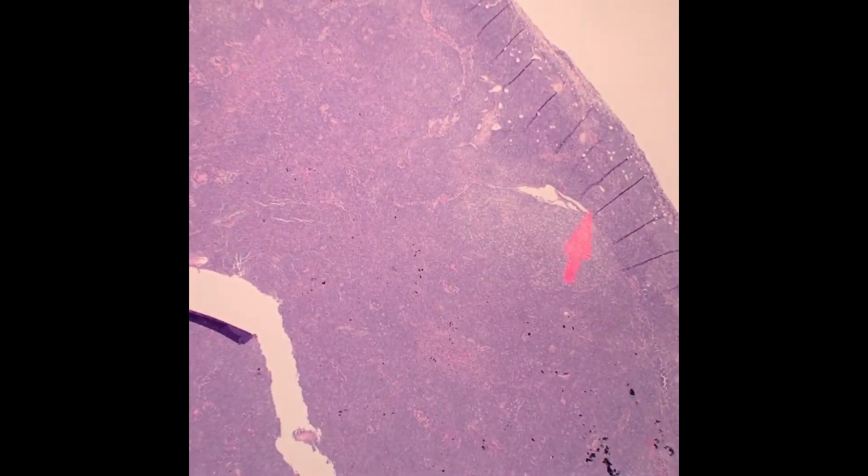First of all, we can see that this lymph node is partially effaced. It's vaguely nodular, but some of the nodularity to me looks like that nodular paracortical moth-eaten pattern rather than the effacing infiltrate. The infiltrate that's effacing the node seems pretty blue and pretty diffuse. Now let's take a look at the cytology of the infiltrating cells.